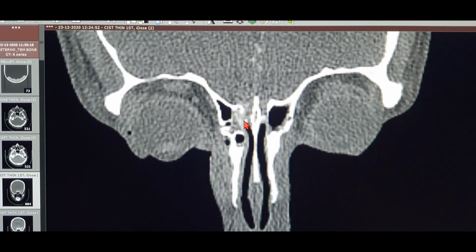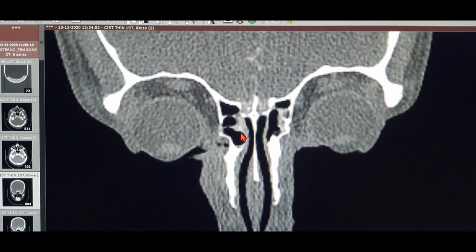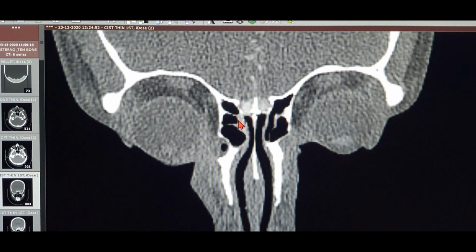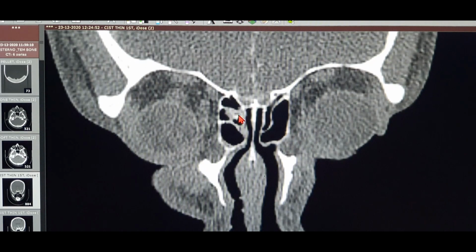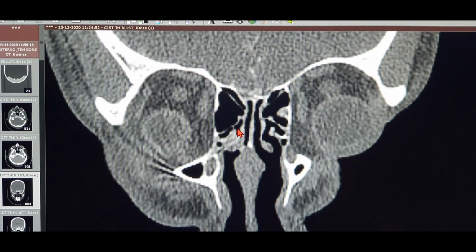And this is the area of the bony defect, clearly seen if you compare both sides, the right and the left, which is pretty much intact. We can see the bony margin over here, but on the right side you can see a deficient area where the bony margin is not seen. This could be the area of the active leak the patient was having. If we keep going behind, we can see there is some fluid collection over here, and the rest of the area seems to be normal without any traumatic positive findings.